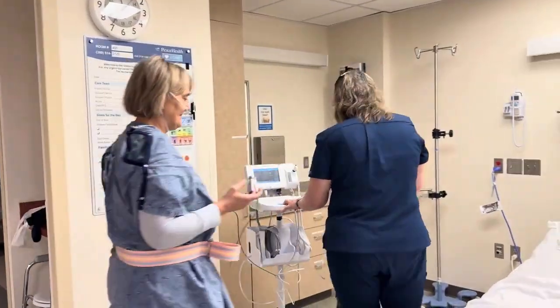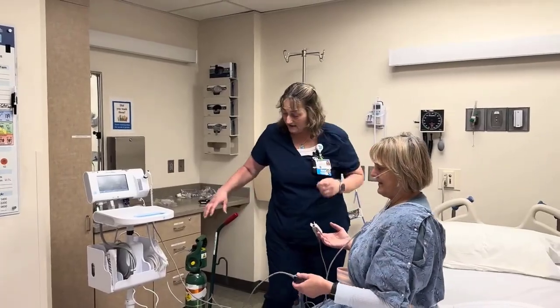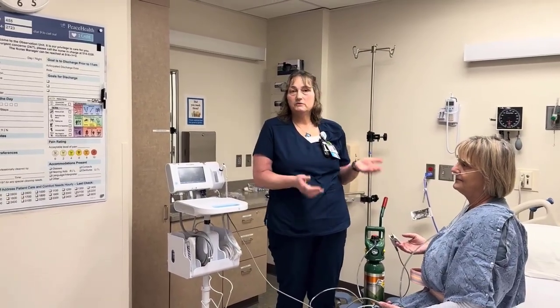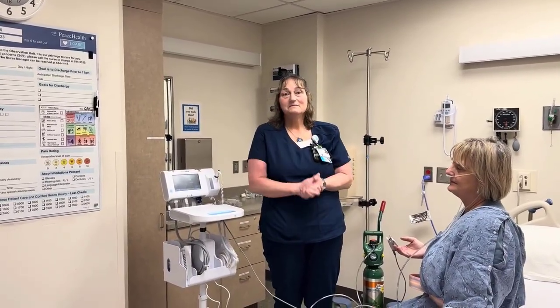Okay, all right, go ahead and have a seat there. I'm going to leave everything on for just a second. I'll get you all put back together. So now what I'll do is I will go back to her chart and I will document that she fell below 88% while walking and doing exercise, and that it took 2 liters of oxygen via nasal cannula to again get her back up above 88% with exercise. Thank you.